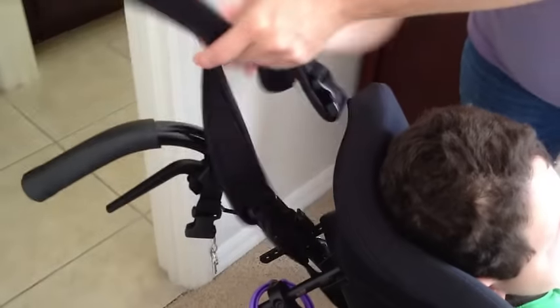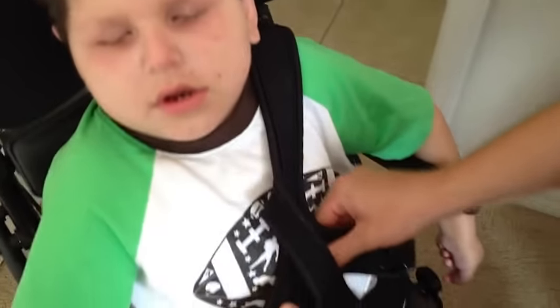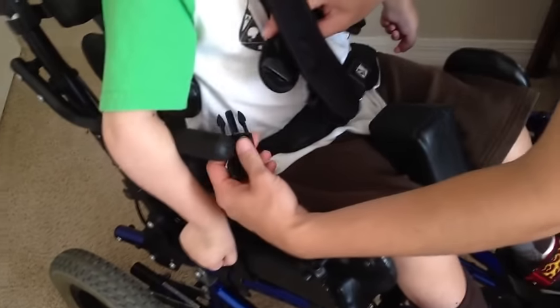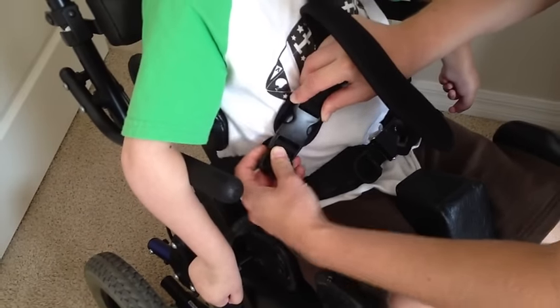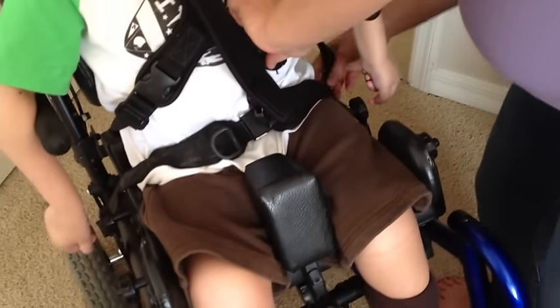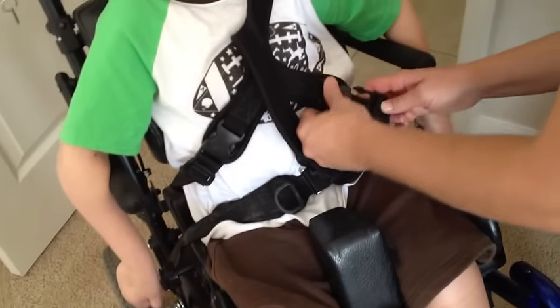Then you're going to want to come around the back. You've got this four-point harness that goes around the back. It's going to come underneath the headrest right there, come across his chest, and you're going to find the other piece down here — the one with the plastic clips — and those are going to snap in together. Then you're going to take the other bottom on the left, find the other strap, and that's going to snap in on the other bottom clip.